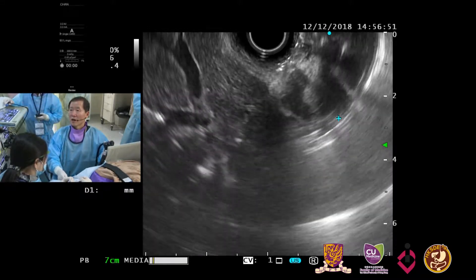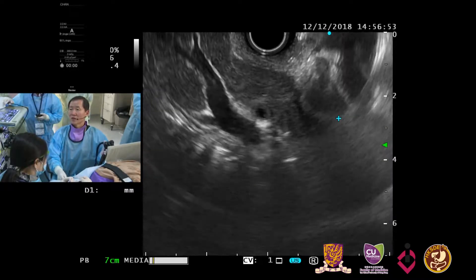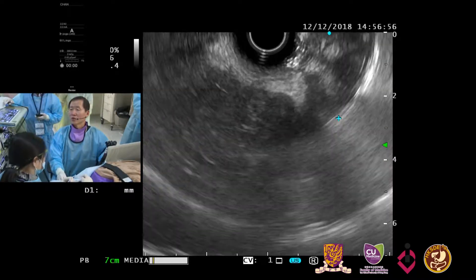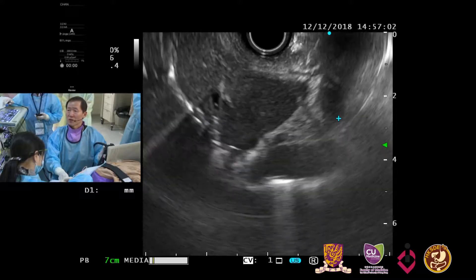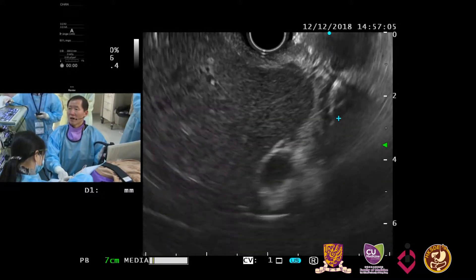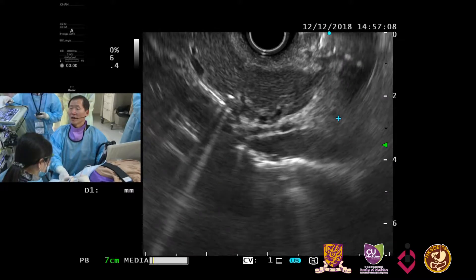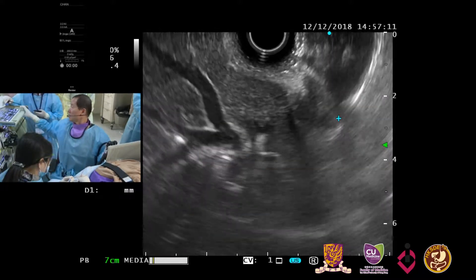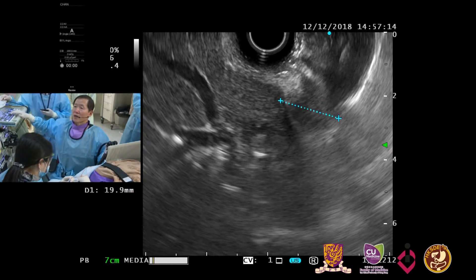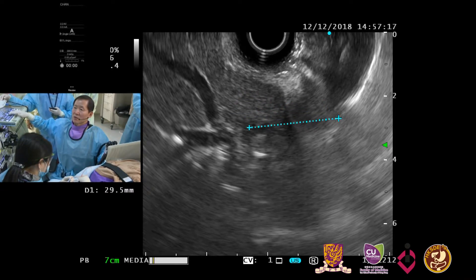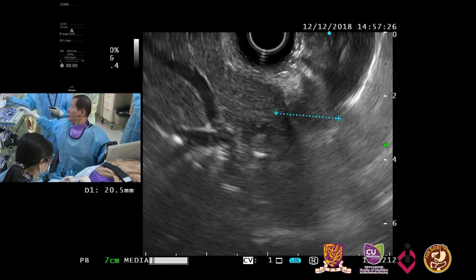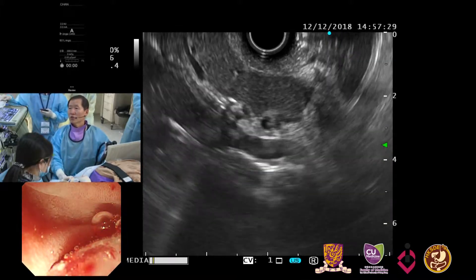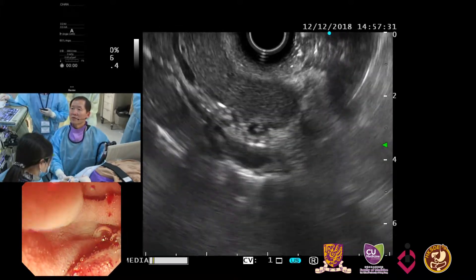We can appreciate the portal vein in the anterior segment. Now I am going from anterior to the posterior side. From here, we can appreciate some echo difference. I'm suspecting some echo difference on this part. Some may not agree, but this part is a little bit suspicious. I will try to look at this area after contrast injection.